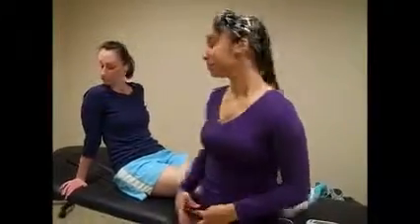The type of unit I'll be using today is a TENS unit and I'm going to show you the protocol. We're going to use a single channel and we're going to apply the TENS pads directly on the source of pain.